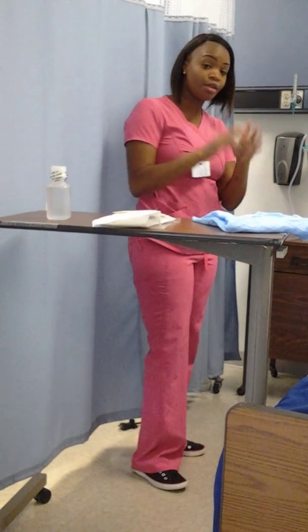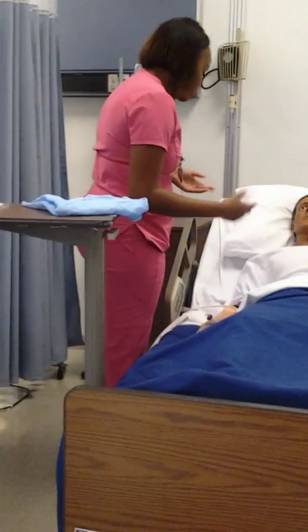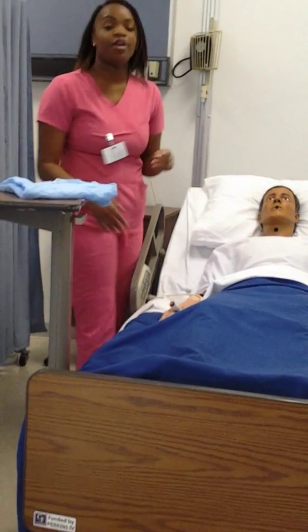Before I get started, I'm going to go ahead and enter the patient's room. I will close the curtains for privacy. Before I touch the patient, I will wash my hands. My hands are washed. Okay. Hi, Mrs. Jones. My name is Tasha. Can you tell me your name and date of birth? Verify her name and date of birth.